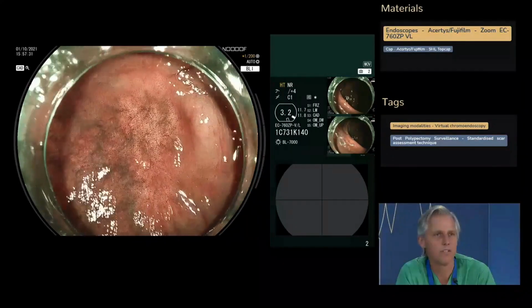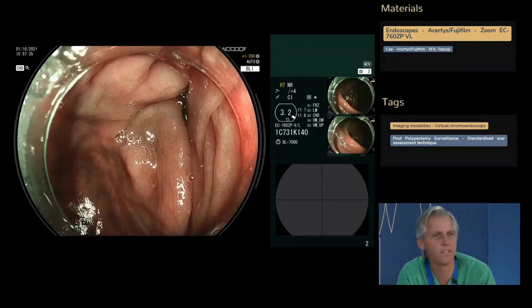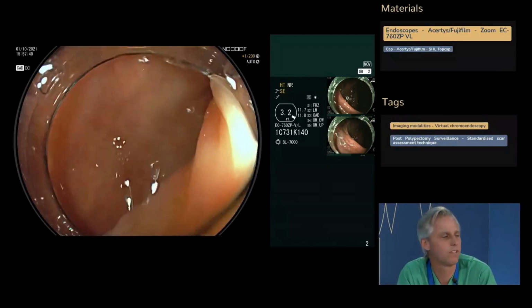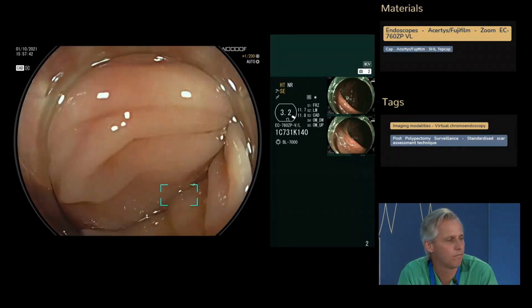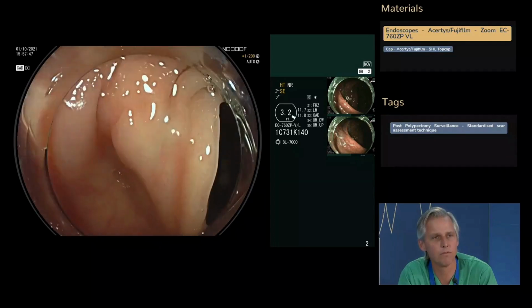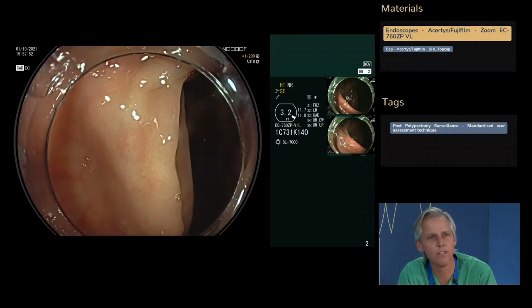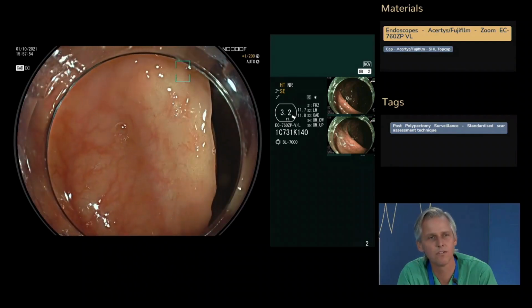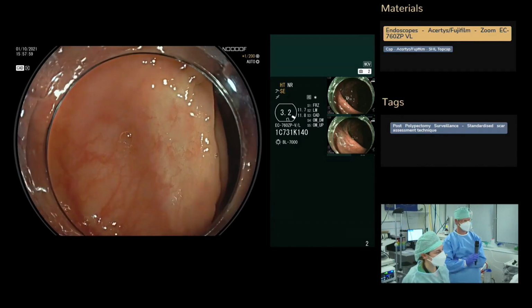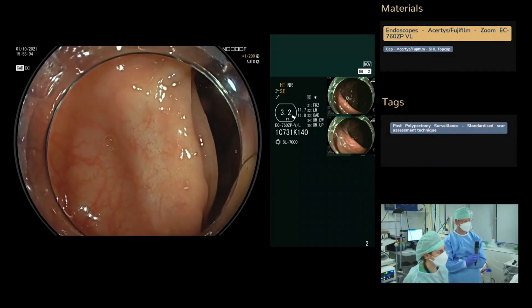Got a question regarding treatment of recurrence. Obviously, we are not seeing any recurrence and not doing a treatment, but during the presentation you mentioned resecting with a biopsy forceps or even a snare, and then applying soft coagulation on the defect. I just wonder how safe it is to do soft coagulation in the defect, or is it much safer because of the fibrotic area underneath?